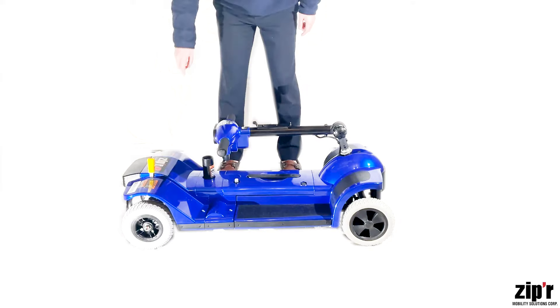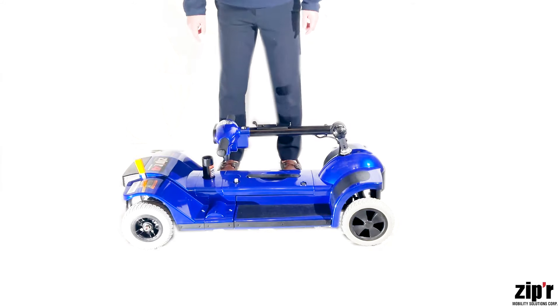Many components of the Zipper Mobility scooter come preassembled, such as the front and rear of the scooter. Start by locking the wheels, pushing the freewheel lever backwards.